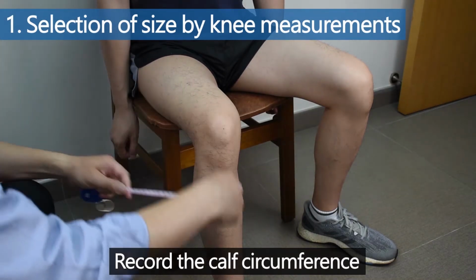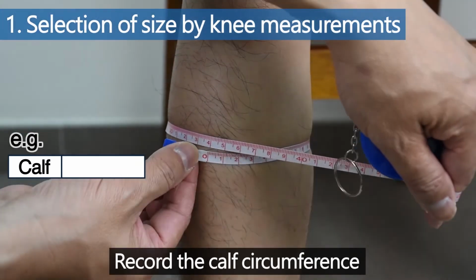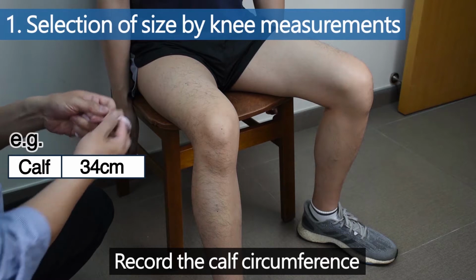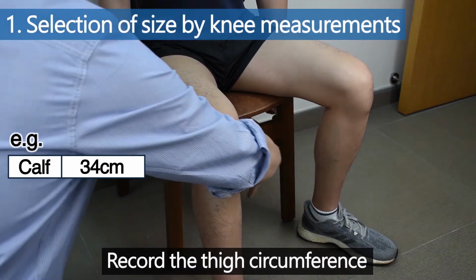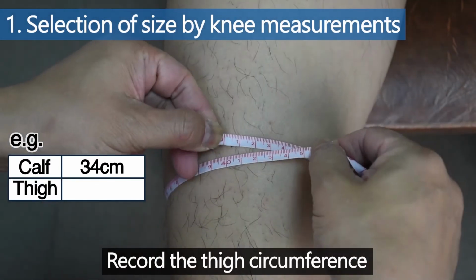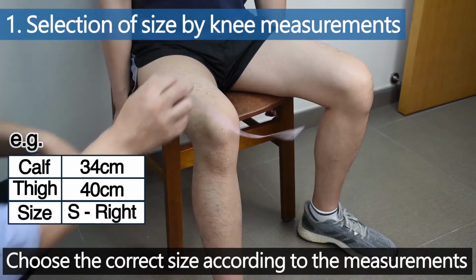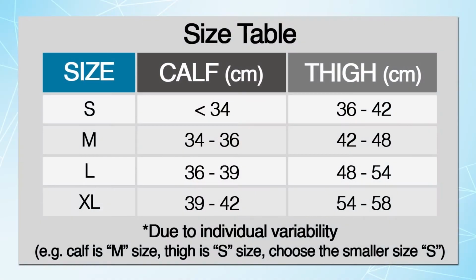Record the calf circumference. For example, the calf circumference of the patient in the video is 34 cm. Record the thigh circumference. For example, the thigh circumference of the patient in the video is 40 cm. Choose the correct size according to the measurements. For example, the patient in the video should choose the small size.